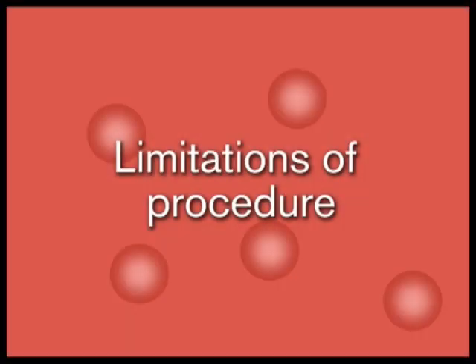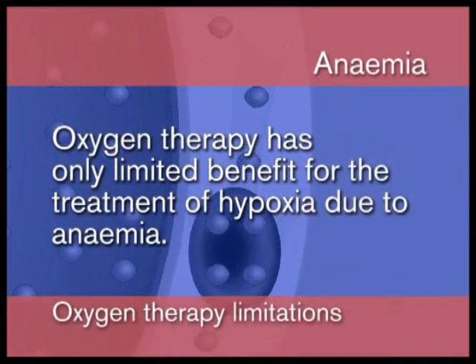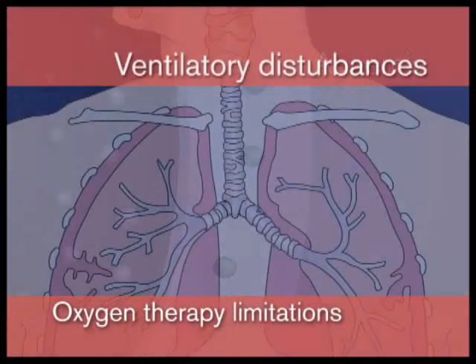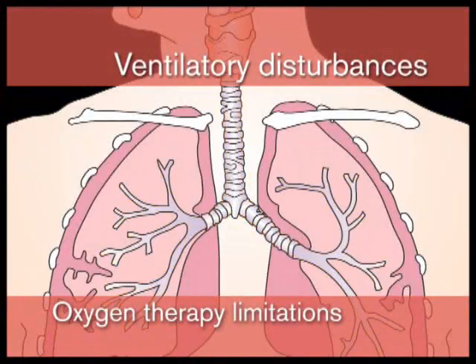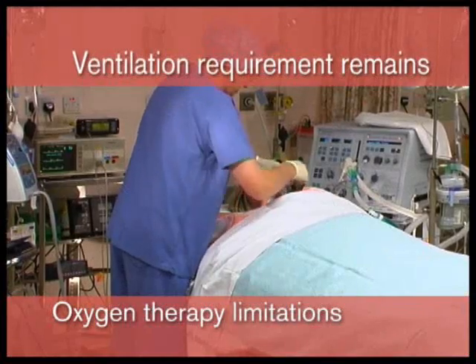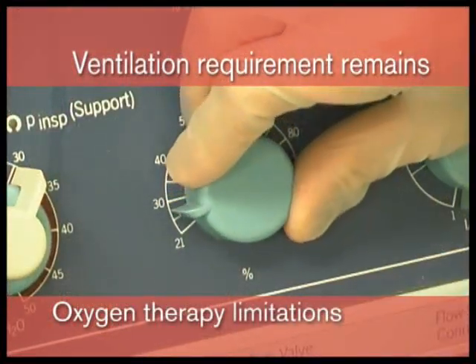Limitations of procedure. Oxygen therapy has only limited benefit for the treatment of hypoxia due to anemia, and benefit may be limited with ventilatory disturbances. Oxygen therapy should not be used in lieu of, but in addition to, mechanical ventilation when ventilator support is indicated.